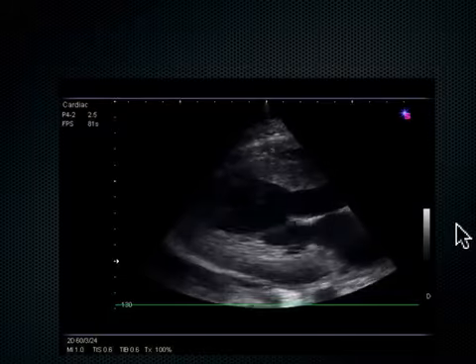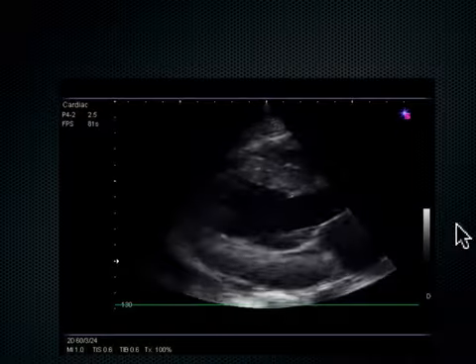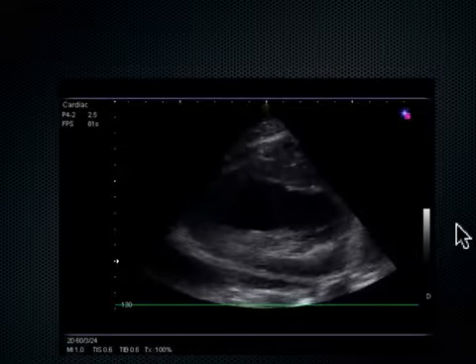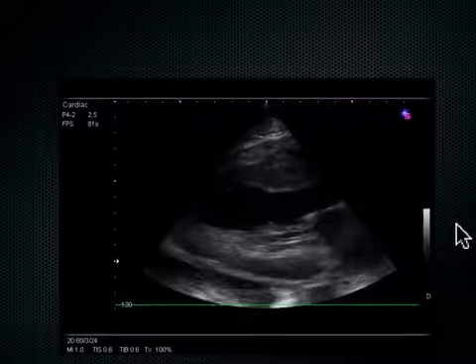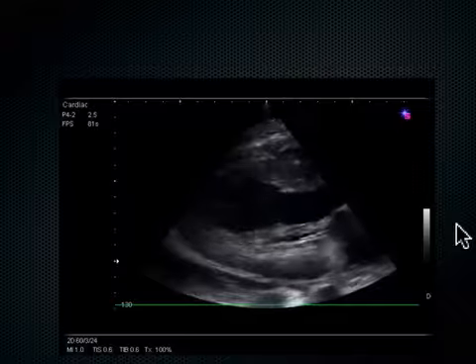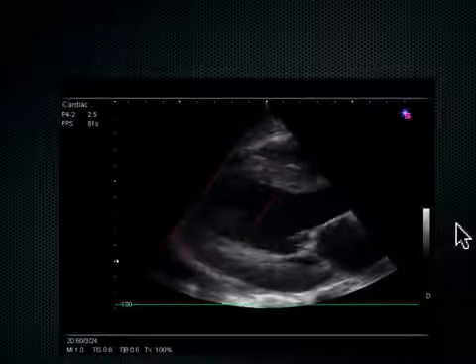And by the way, the reason why I look at that, it's the physical mechanics of the flow of the blood going from the RA to the RV. As it moves through that from RA to RV, I'm sorry, you're right, LA to LV, as it's being sucked through that valve, it smacks that valve up against the septum. If it's going through with a good enough velocity to do that, good enough pressure change from that LV working so well, it causes that septal leaflet to smack the septum. So when it's not doing that, we know there's decreased LV function. Does that make sense?